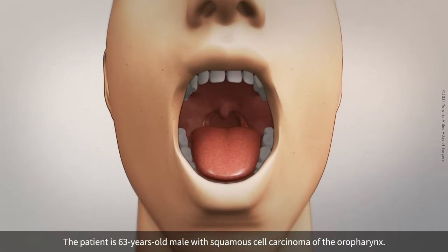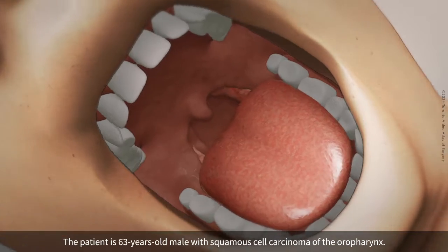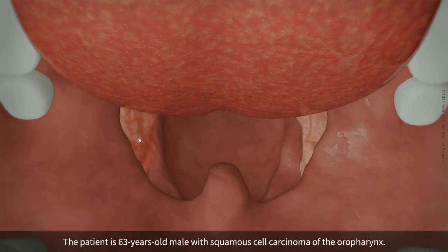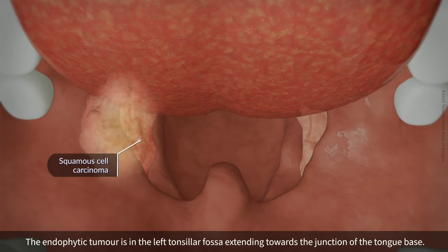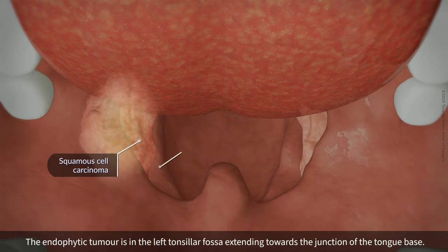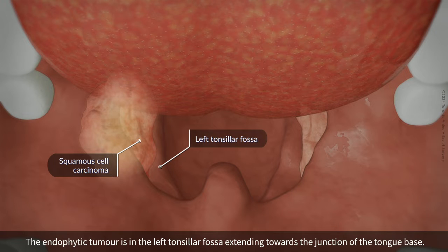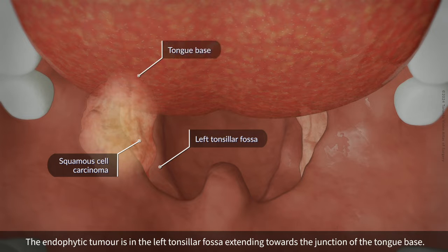The patient is a 63-year-old male with squamous cell carcinoma of the oropharynx. The endophytic tumor is in the left tonsillar fossa, extending towards the junction of the tongue base.